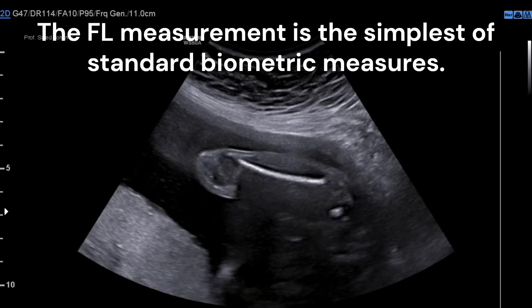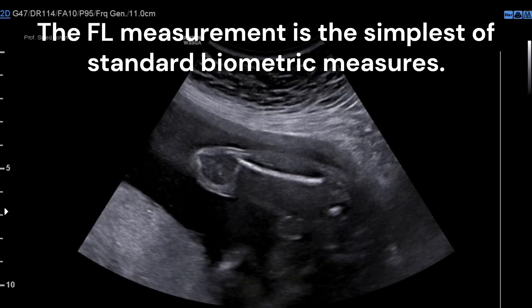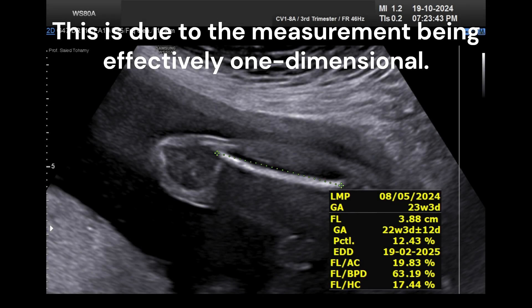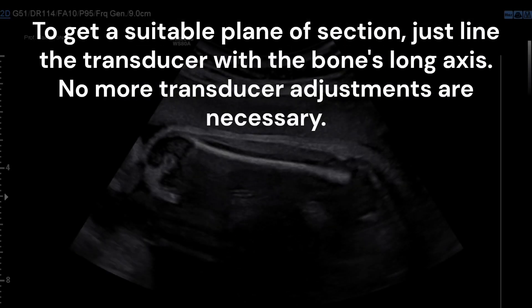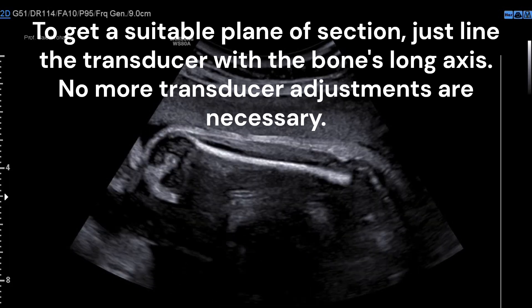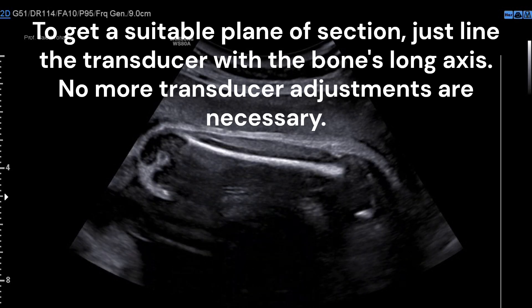The femur length measurement is the simplest of standard biometric measures. This is due to the measurement being effectively one-dimensional. To get a suitable plane of section, just line the transducer with the bone's long axis. No more transducer adjustments are necessary.